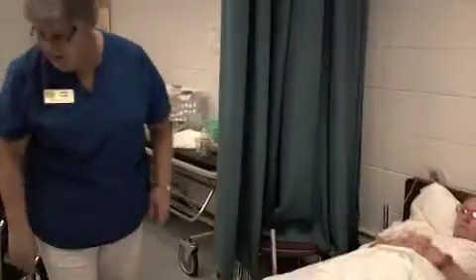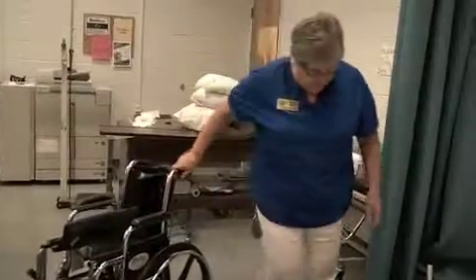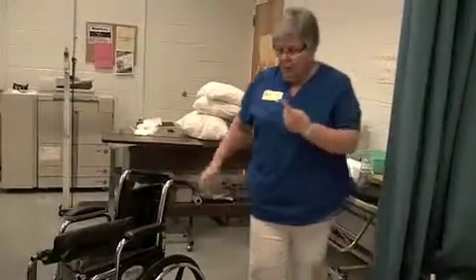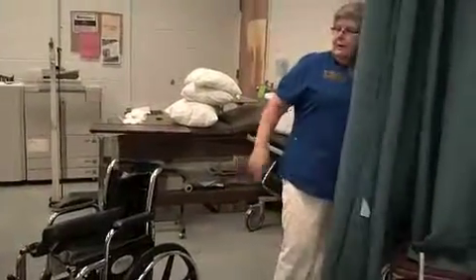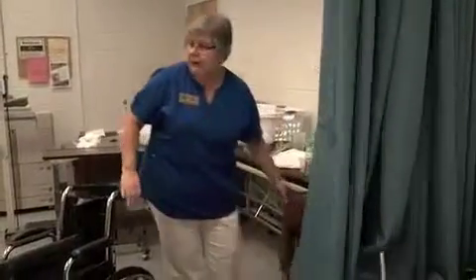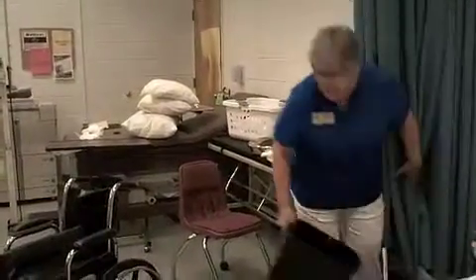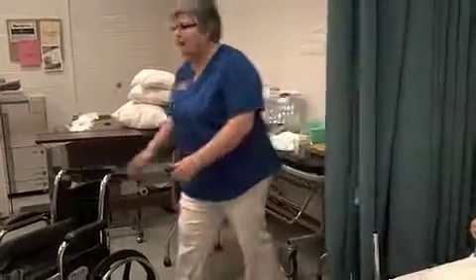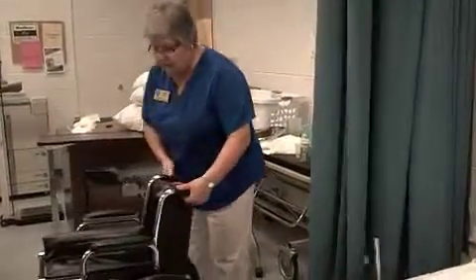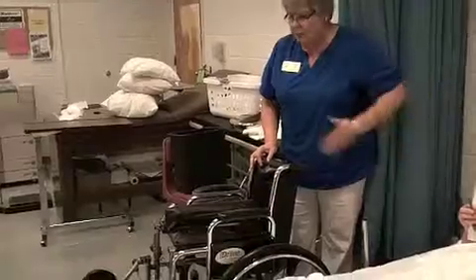Alright, Miss Beth. Check this bed — be sure we are all safe and secure. And we are. I'm going to place my chair. Notice it says if the head points toward the foot or the foot toward the head — that's the clarification that has been made and changed. Before we didn't have that clarification, but we have it now, so that's helpful. As far as which way to do it, in real life you do it according to the patient — you get them out on their strong side. But for testing, you put that wheelchair where you have the least intrusion of other furniture.